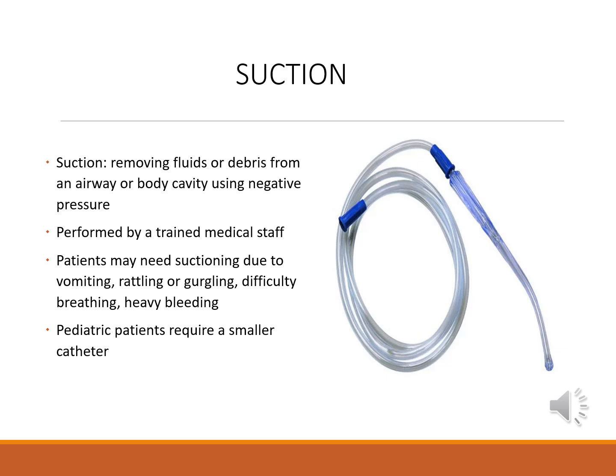They are also responsible for daily checks of emergency suctioning equipment within the department to ensure it's functional and stocked with necessary supplies. Signs that a patient may need suctioning include severe vomiting, audible rattling or gurgling, difficulty breathing, and heavy bleeding from facial injuries with an obstructed airway.